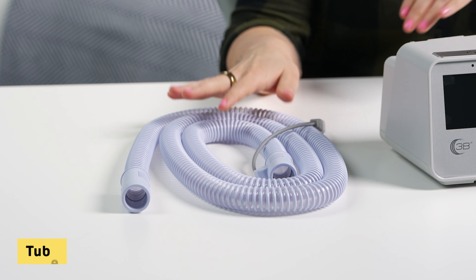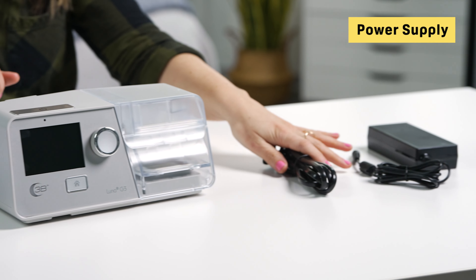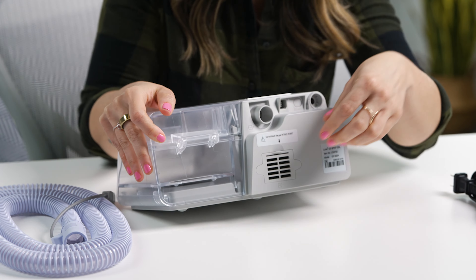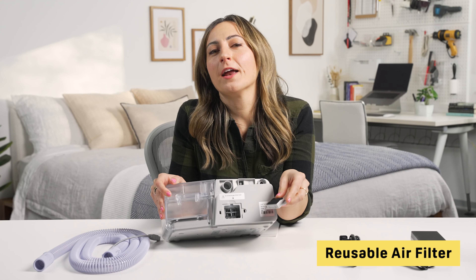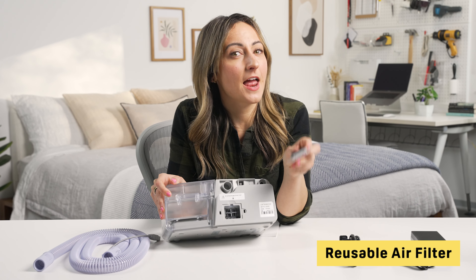Alright, let's get into the Luna G3. In addition to the machine, your order comes with a tube that connects the machine to your face mask, allowing air to travel from one to the other without losing pressure. You also get a power supply for connecting your machine to an outlet and a user manual to help you install the machine and troubleshoot any issues. There is also a reusable air filter to protect the machine from contaminants. You'll want to clean your filter with warm soapy water every two weeks and replace it after three months.